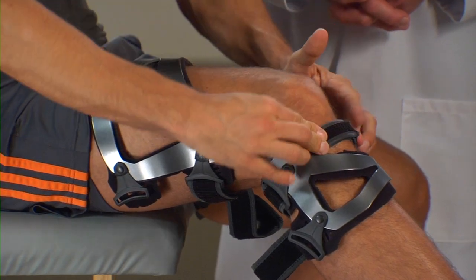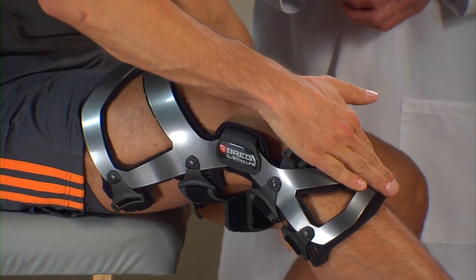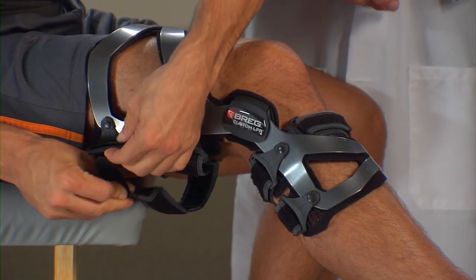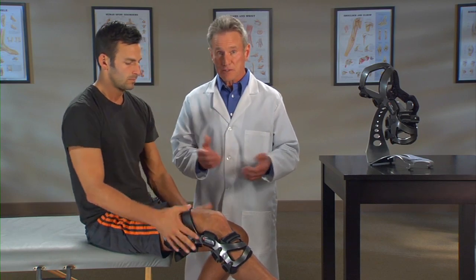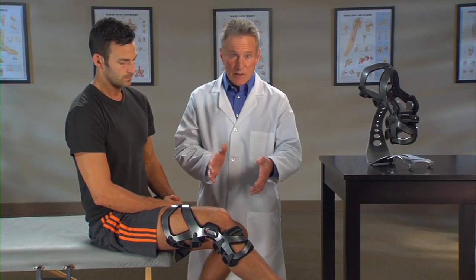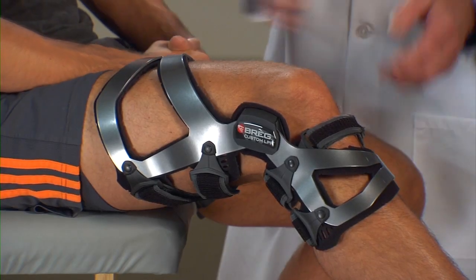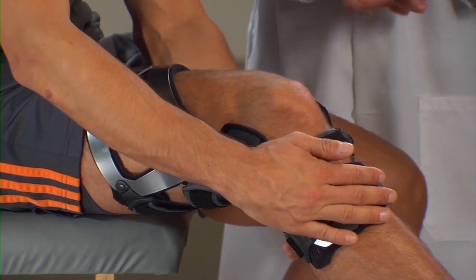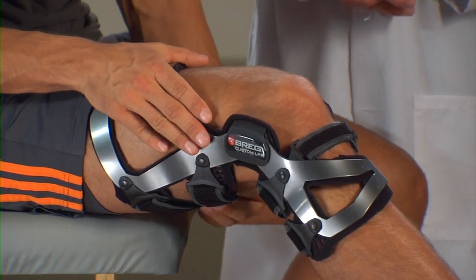Next, fasten strap four in the back at the bottom of the brace. Then, fasten strap five in the back at the top of the brace. After you've been active for a while — about five minutes or so — your body fluid levels will change, making your brace feel loose, so you'll need to re-tighten the brace straps. To re-tighten the straps, sit with your knee bent at a 30-degree angle like before. Press the thigh and shin cuffs flat against the front of your thigh and shin. Loosen and then re-tighten each strap one at a time in the proper order to adjust the brace fit. Remember to apply equal tension to the straps.